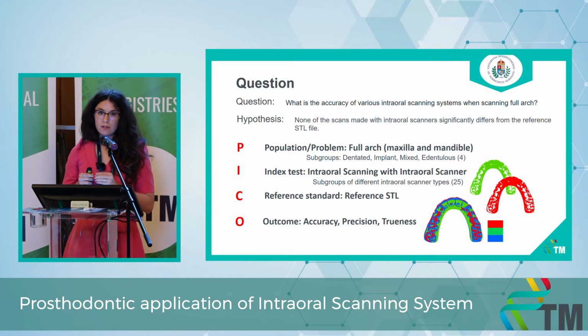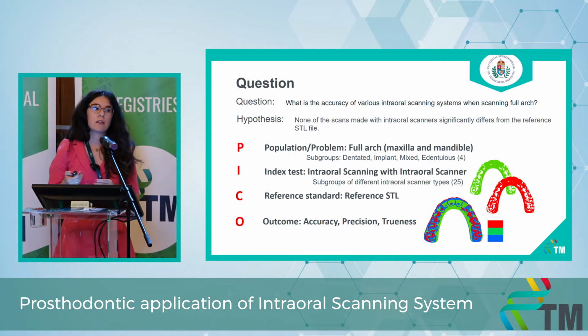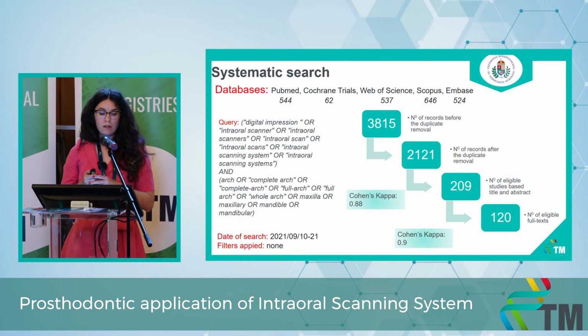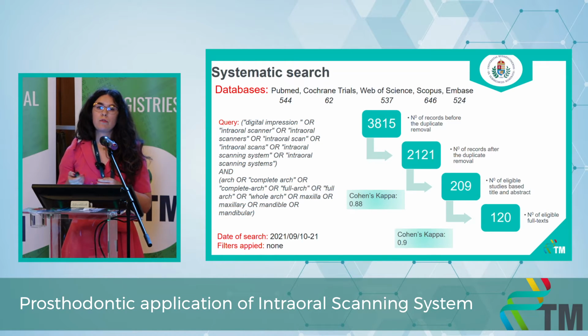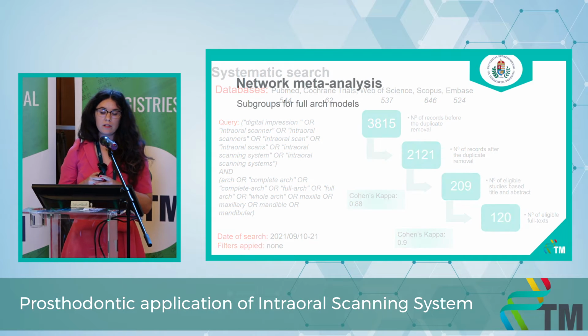The reference standard is always a reference STL made with a reference scanner, and our outcome is accuracy made of trueness and precision. My systematic search involved 5 databases, and in the end I got 120 eligible articles, and 55 were involved in the network meta-analysis part.